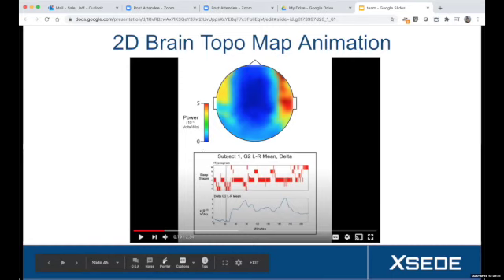In the middle, the red plot is the sleep hypnogram, and at the bottom is one of the time series from subject 1's G2 delta activity. But if we step through the data, we can see the lines line up with the different sleep stages, and we can draw visual correlations with the locations in the 2 different hemispheres and where we see high activity in red and low activity in blue.